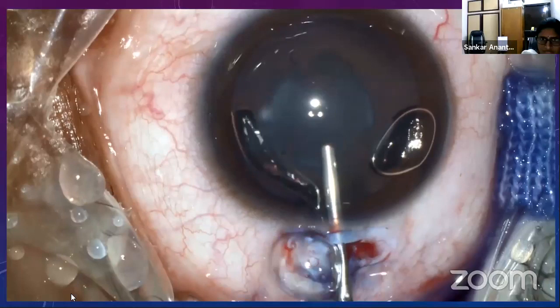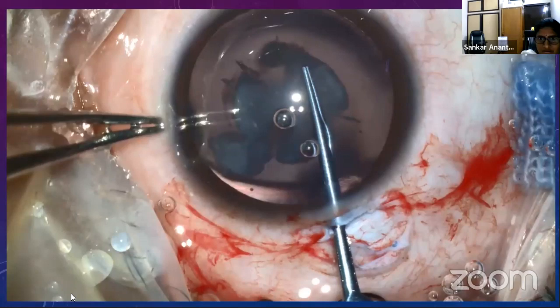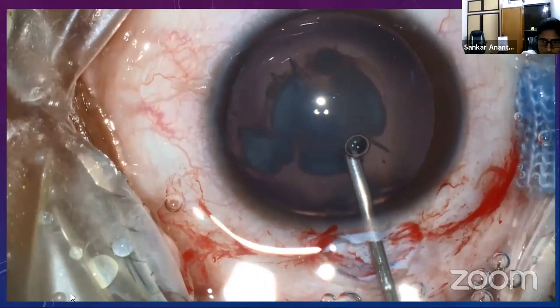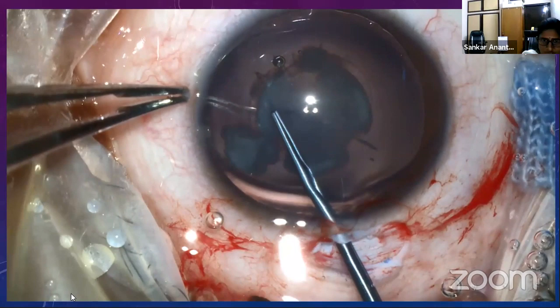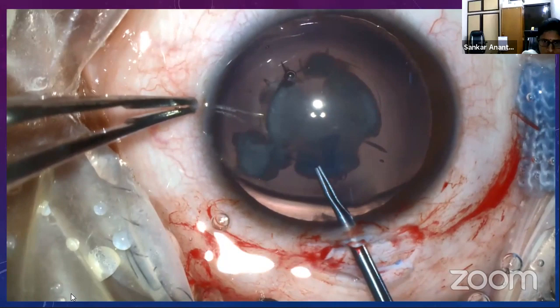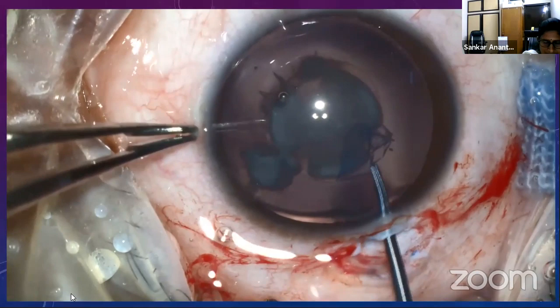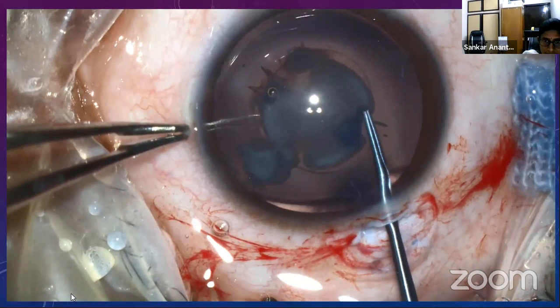The anterior capsule is given a nick. The rhexis is fashioned with the micro rhexis forceps. Frequent grasping and re-grasping of the capsular flap allows better control of the rhexis. Here, force on the anterior capsule should be centripetal and upwards towards the corneal endothelium to prevent peripheral extension of the rhexis. Ideally, we can aim for a 4.5 to 5 mm rhexis. Now the anterior capsular rhexis is completed.